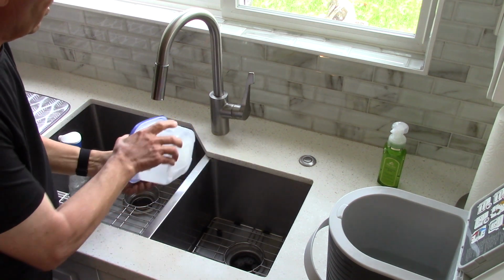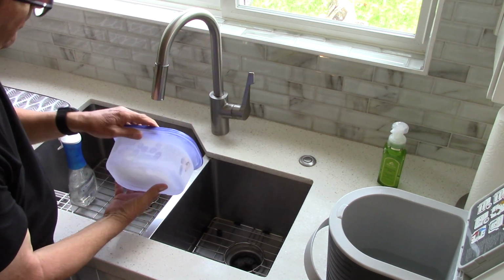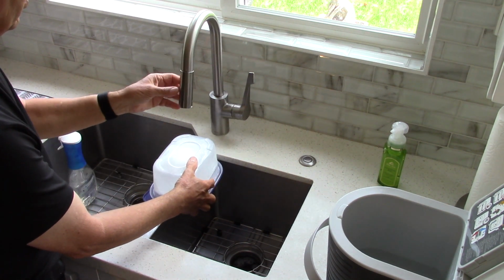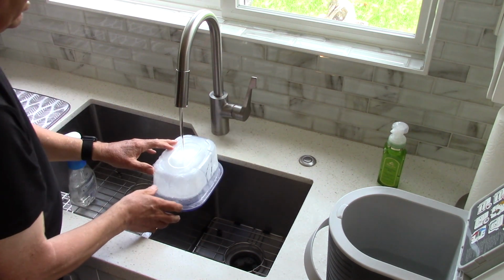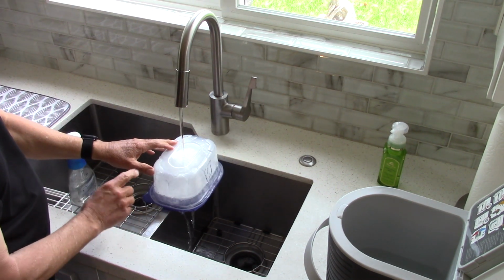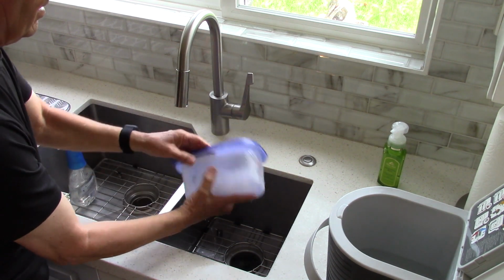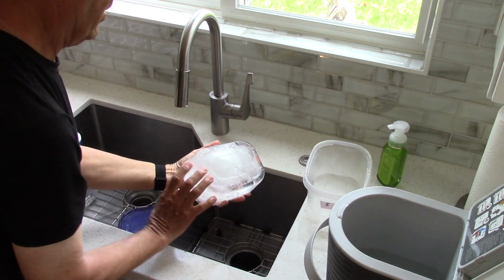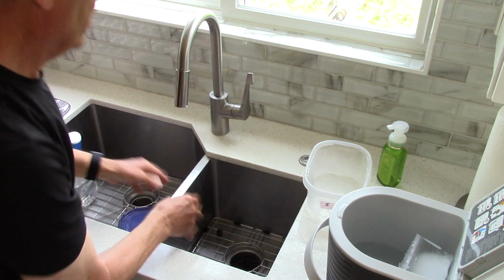So how do you thaw these things out so they fall out of the tub? I was doing all kinds of stuff going around the edge and it didn't work very well, and I found the best way was just to flip them upside down, put warm water right in the center there, and then usually they just drop. You'll hear it in a second. That's it. And then you can take it and go like that, flip it out. You may want to have some rubber gloves on if that bothers you. And then there's one in the bucket.